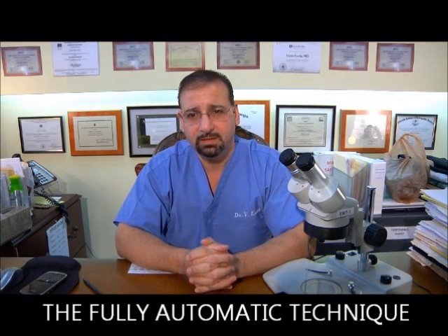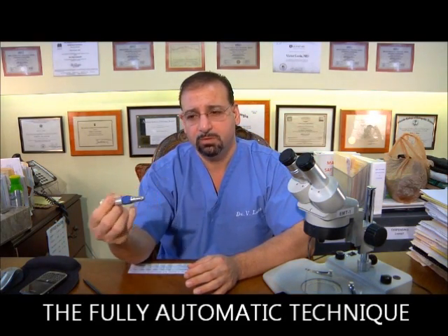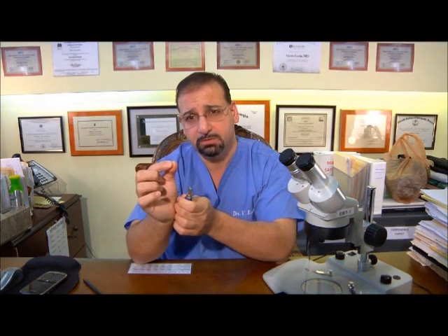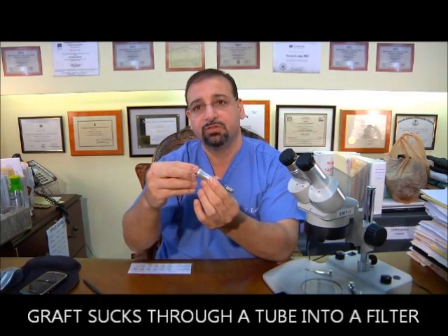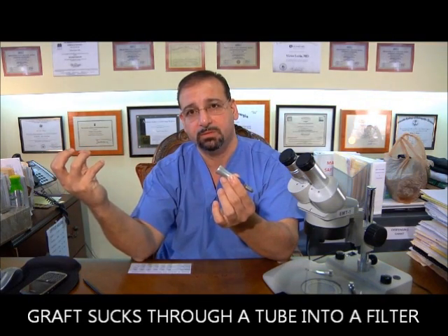The fully automatic technique will use an engine like this, same thing — we'll cut into the scalp with a similar device, a similar cutting end like this titanium punch. What happens is the graft would actually suck through a tube at the back of this and fill up a filter.